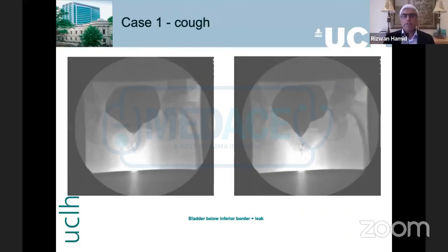Again, I'm not going to diverge into the argument about what type of urodynamics one does. I try to do video urodynamics. That's how I've been taught. I think that is the best test. In the video, you can see what is going on. Without video, you can't see what is going on.